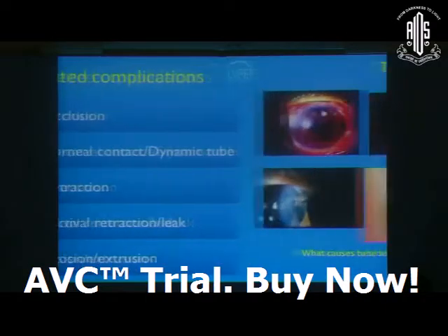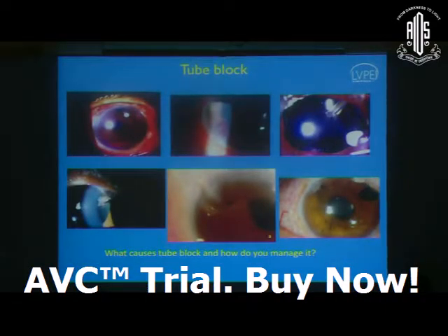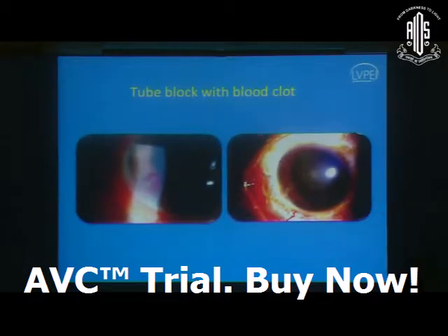Apart from that, the tube related complications, whether it is the tube that is present in the anterior chamber or the subconjunctival space, is something that all of us worry about. So the tube block can happen in the early postoperative period, especially because of a blood clot. Depending upon where you try and place your tube, when we are entering into the anterior chamber, however careful you are, especially if you have a very anterior peripheral anterior synechia, you can end up having a blood clot. Most often these blood clots are innocuous, they really don't trouble. You treat them with a little more anti-inflammatory and they just disappear.